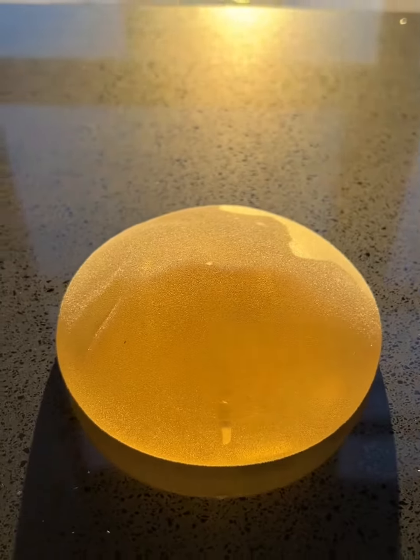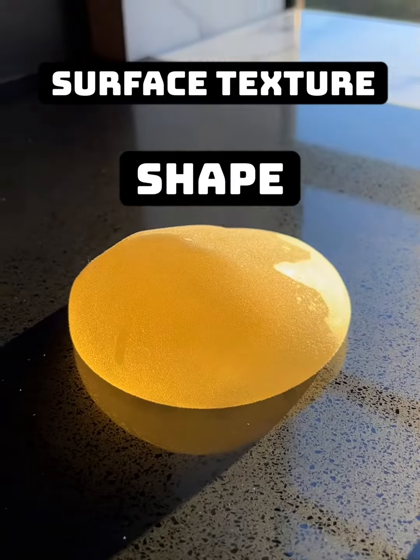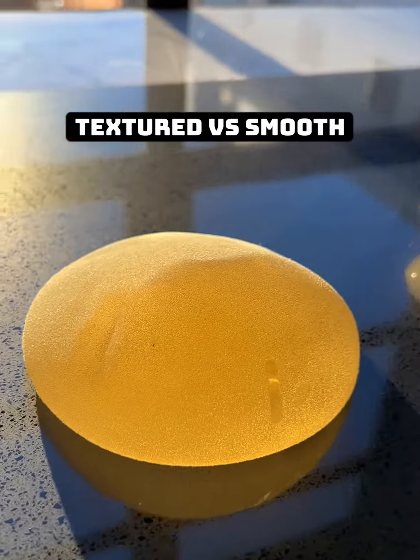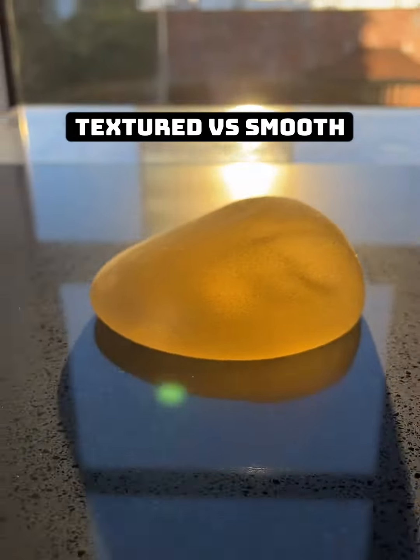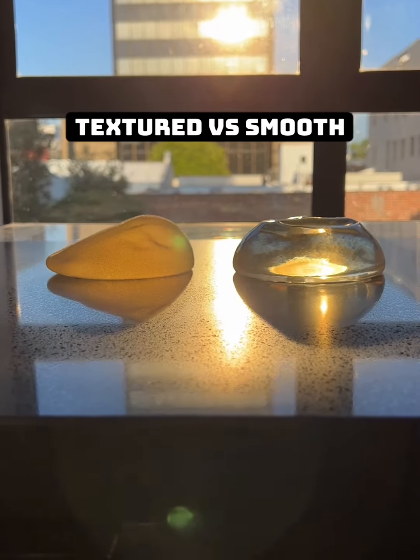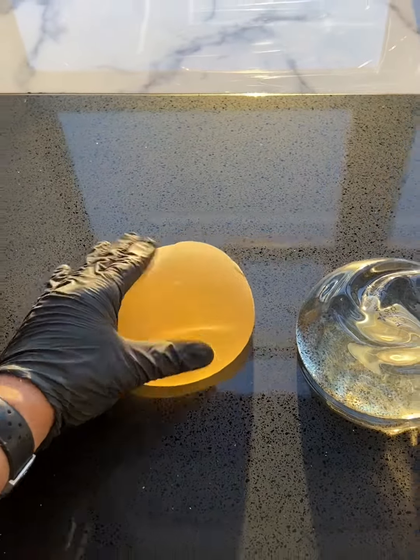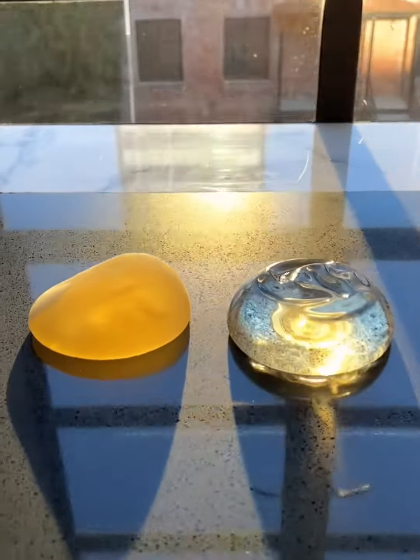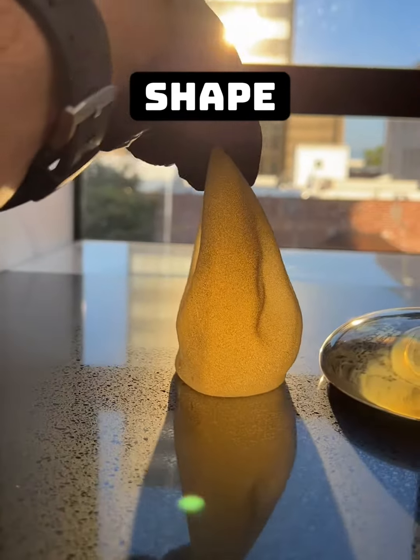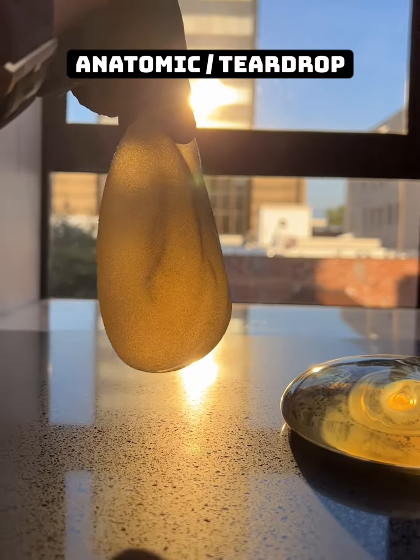The last variables are texture and shape. Textured implants are rarely used in the United States. However, they do serve a role in patients who suffer from repeat episodes of a complication called capsular contracture. The surface material helps decrease the risk of a repeat deformity. The shape of this textured implant is referred to as an anatomic teardrop implant.